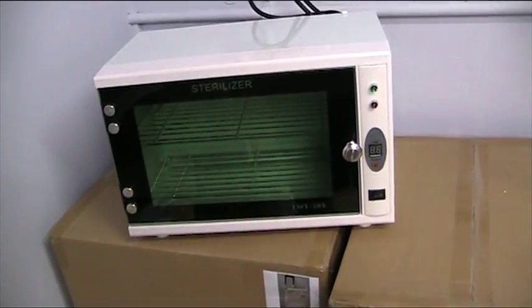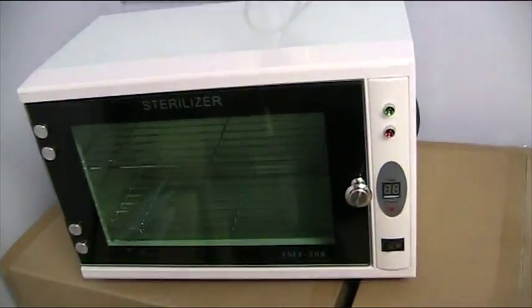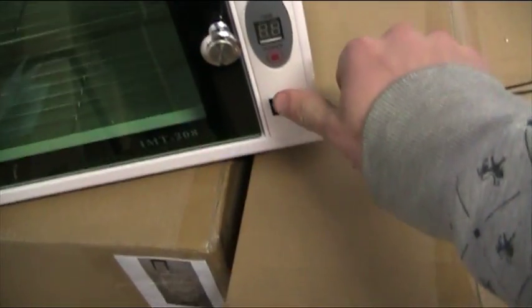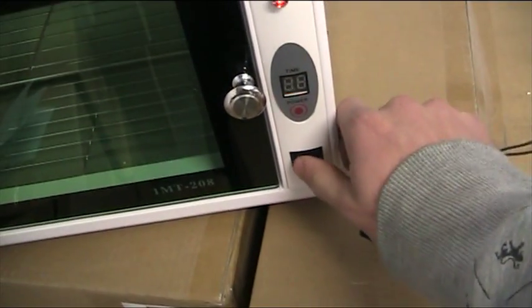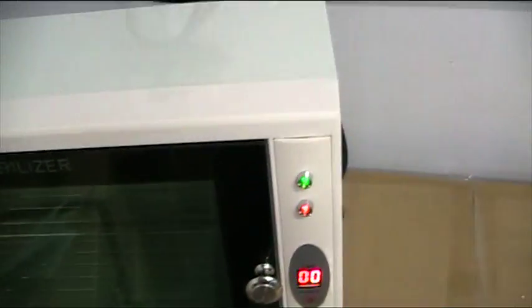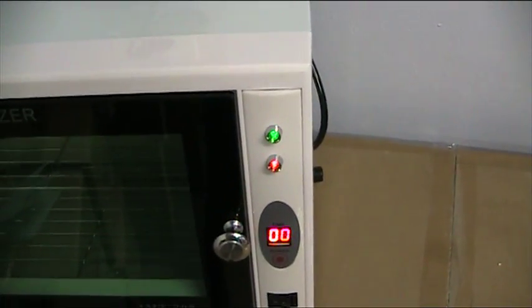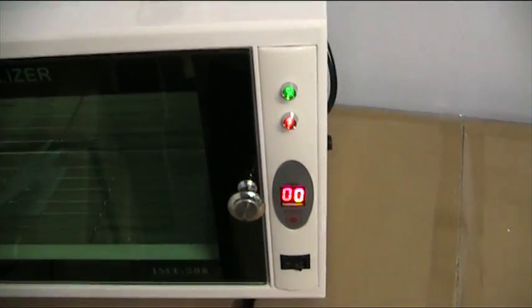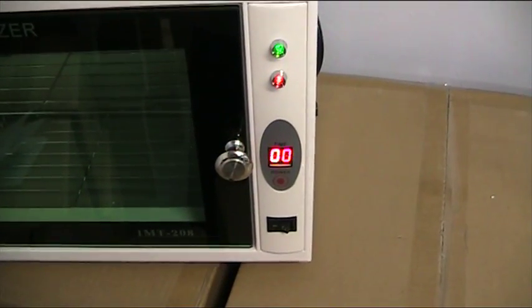To operate this unit it's simple. You have your power button, switch on. You have your green and your orange light, you have your timer.